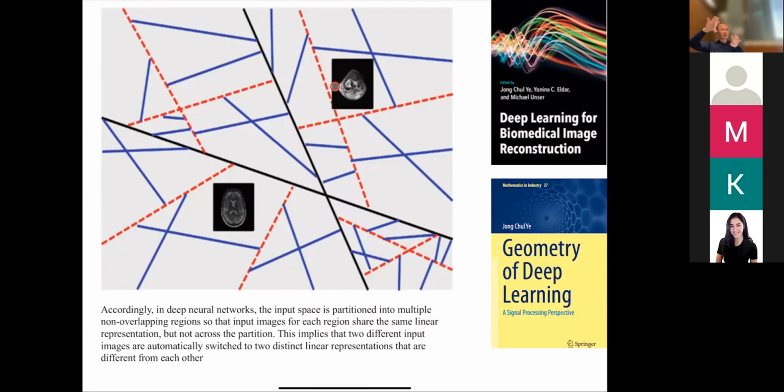So it's actually smarter. It does this splitting of your data, telling it what the best solution space is to do your operation in. So that's where the geometry of deep learning, these nonlinearities, actually helps you. Essentially, you're driving yourself into the space of solutions that you want.